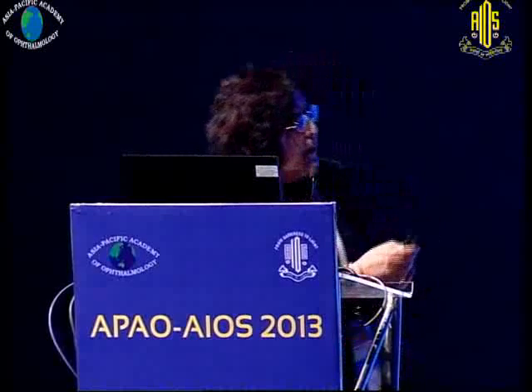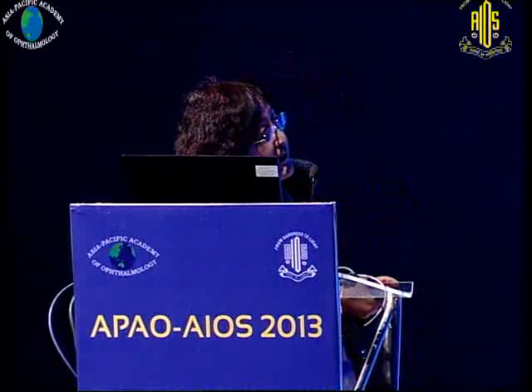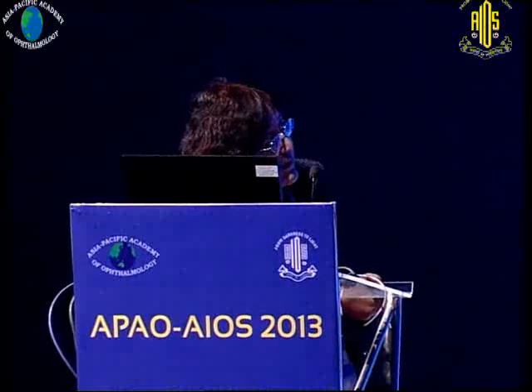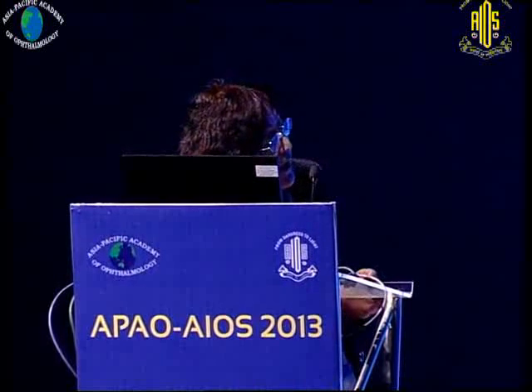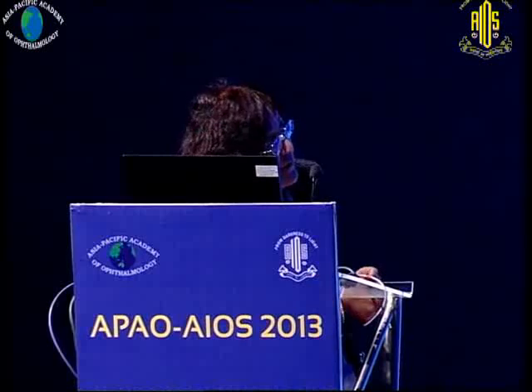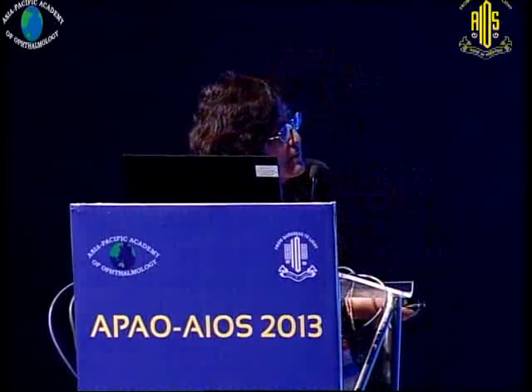My first laser experience is not for the optic pit, but for this disc coloboma. This is very similar, just the size differs, I think. Here is the optic disc. The first laser is in this range, and the yellow is my second laser range. I treated the circular optic disc, but there was still subretinal fluid.